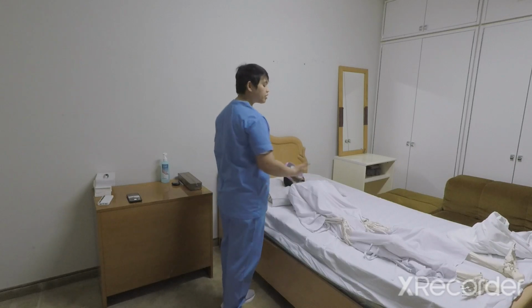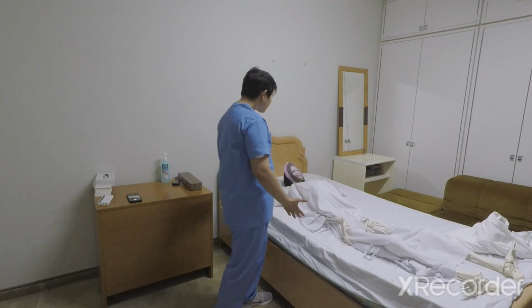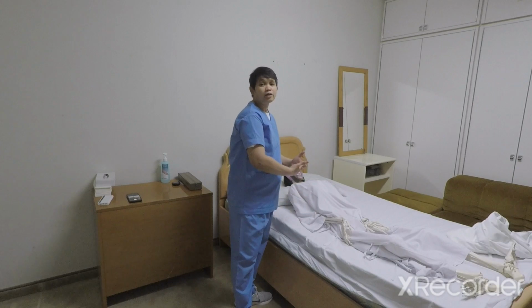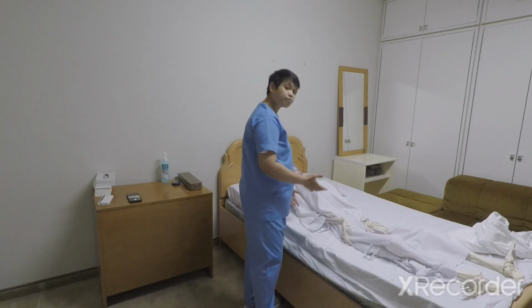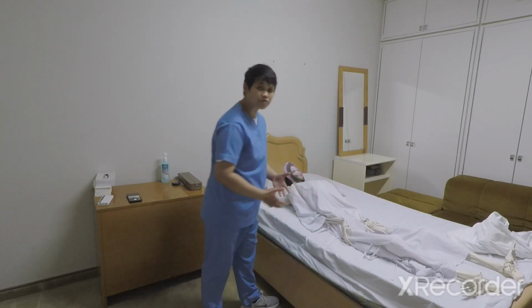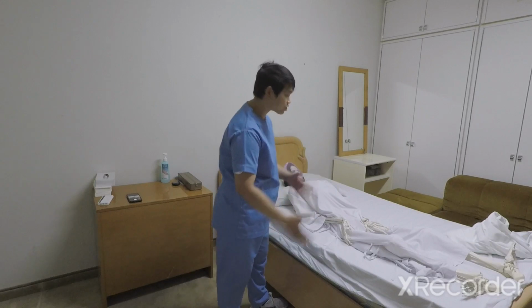But in the home setting, there will be no such bed that will lift the patient. So, the first thing we have to do is check the vital signs before proceeding to the transfer. After checking the vital signs, everything is okay.